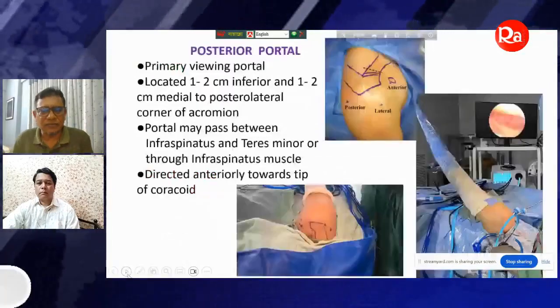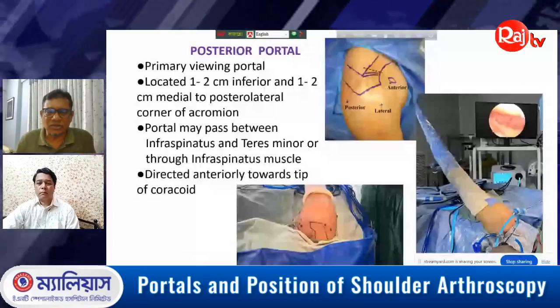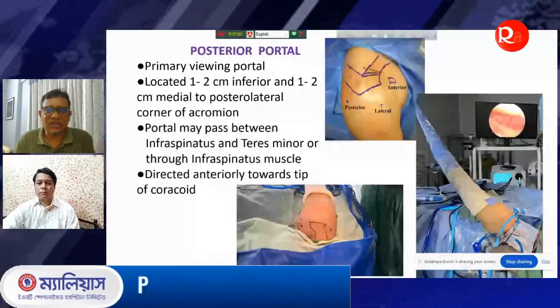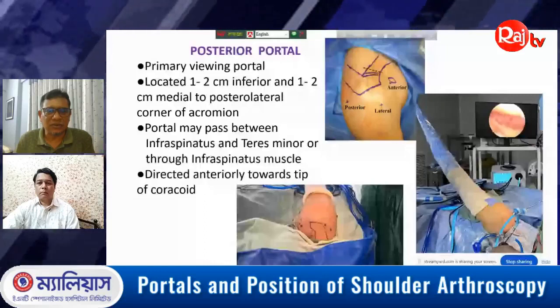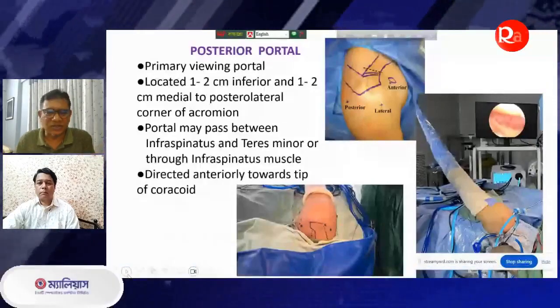Now come to the portals. There are several portals for shoulder arthroscopy, and among them, some are very important. I will discuss them here. We will be discussing these portals in the next slides.